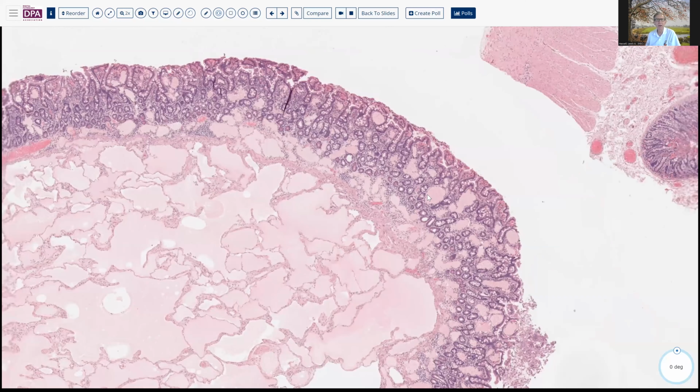The diagnosis here is not particularly challenging. It's just unusual to see this because this is an uncommon primary lesion in the small bowel. We see them with some frequency in other locations in the body, in the head and neck region, of course, and more frequently in younger patients in that environment. But in the small bowel, they tend to be a little bit older patients and not associated with some of those syndromes that are more prevalent in younger children.